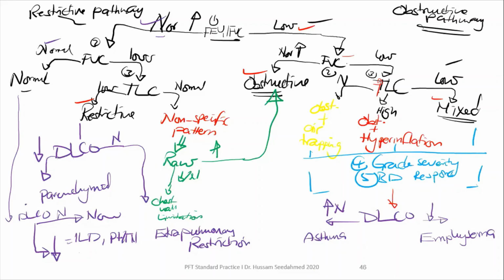So this is the stepwise approach in how to interpret the PFT, spirometry with the lung volumes, until we reach, at the end, a differential diagnosis.